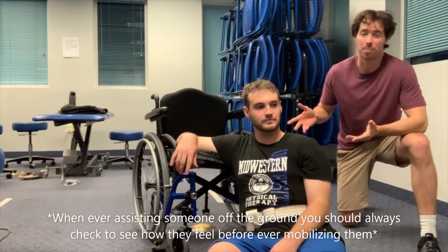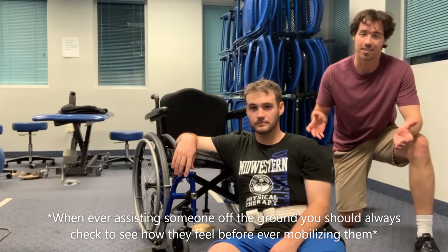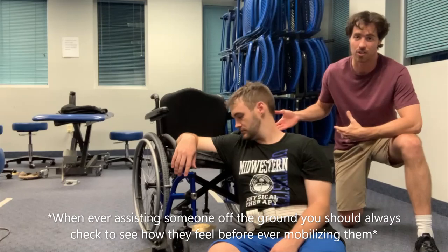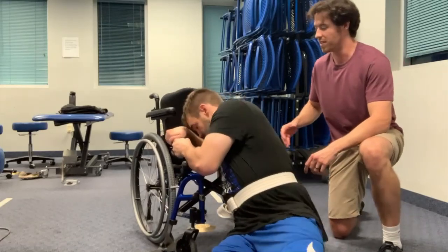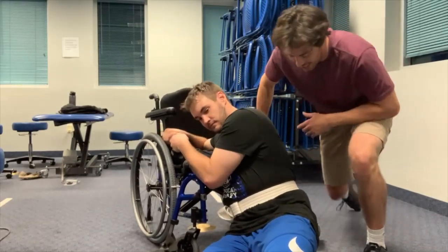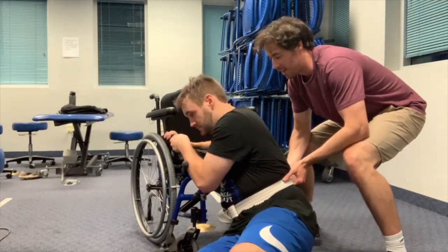Alright, now as a healthcare professional you need to help somebody that has that T10 below paralysis. You need to apply moderate assistance for them to get into the wheelchair. How I would go about this is I would apply the gait belt to Jordan here. He would get into the position of the side turn, scoot his hips nice and close to the chair, then I would get into a nice deep squat, grab the gait belt that I've already applied, and we will do a three, two, one count.